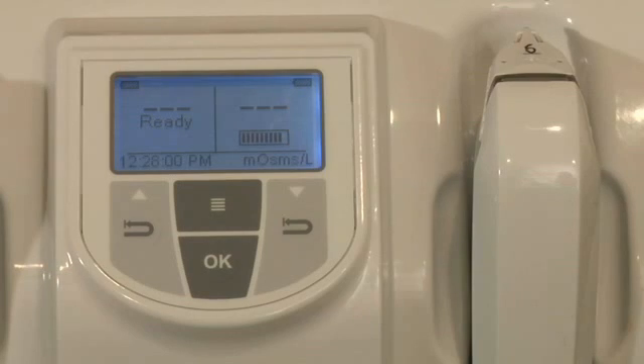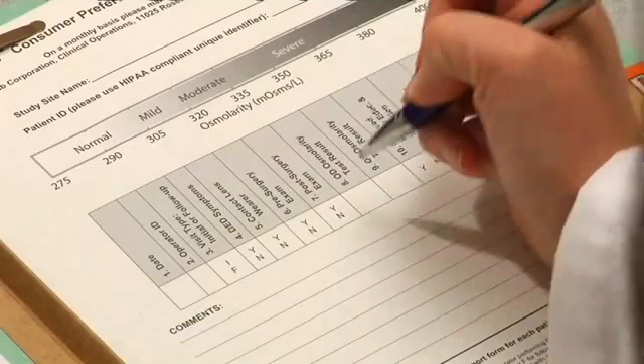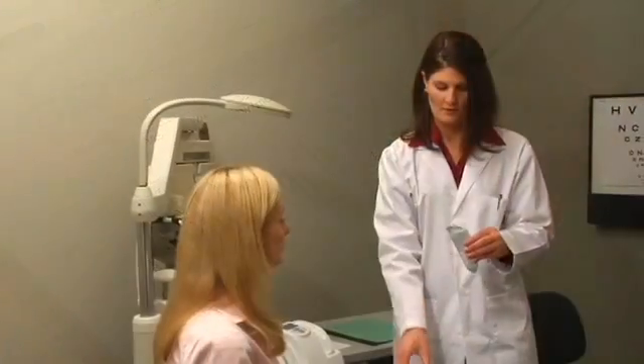Wait for the result and record the result in the patient chart. Repeat the procedure on the other eye with a new test card.